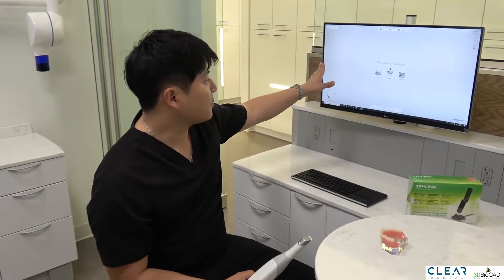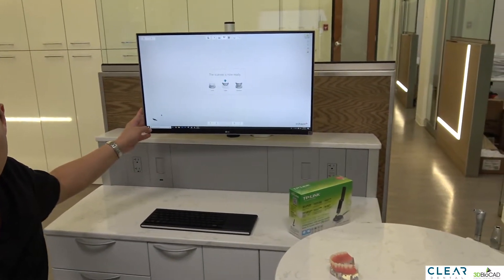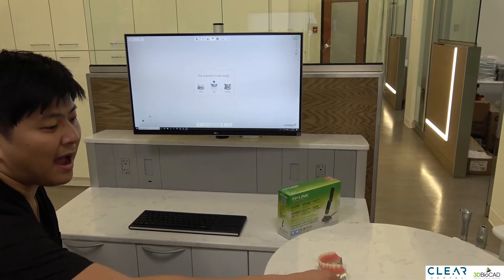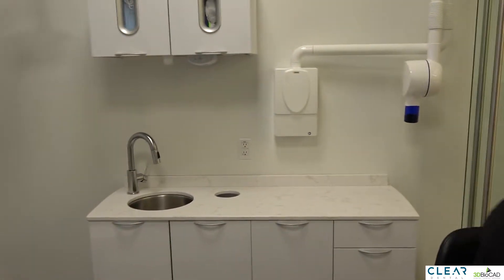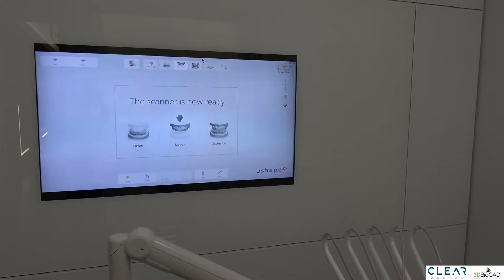We have the computer monitor at the 12 o'clock position, but it's not a really good position for scanning. So what we have is we have our assistants move the window from the 12 o'clock position to the 6 o'clock position on the TV screen.